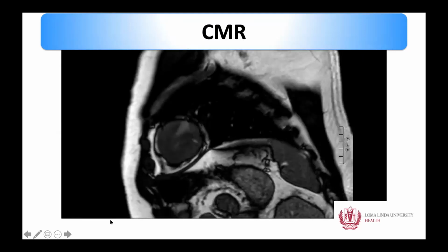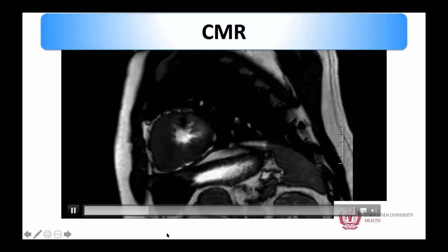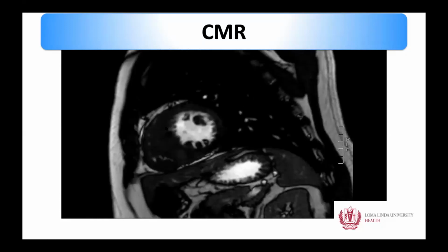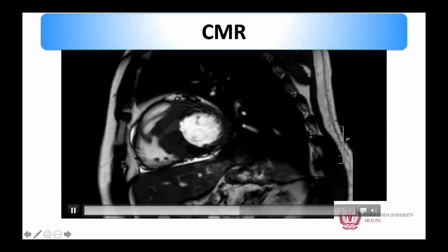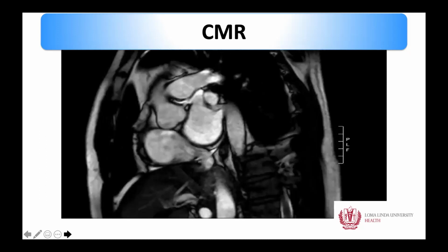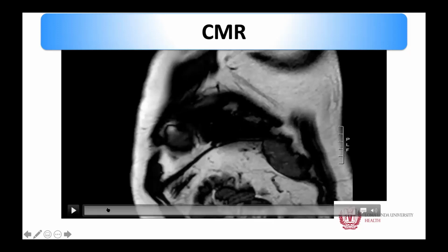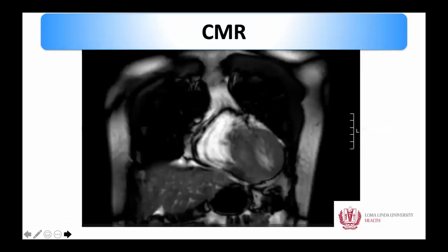So just quickly showing you guys the cardiac MRI on this patient so that you get some multimodality context. I have some slides on MRI, and then we'll go to the other cardiomyopathies. You can again see that the extent of the LVH is nicely seen here on MRI, and we saw that on echo as well. So this is one of those lucky patients where we can see it well on both modalities. Let me just go to the money shot. I'm going to make sure we cover everything.